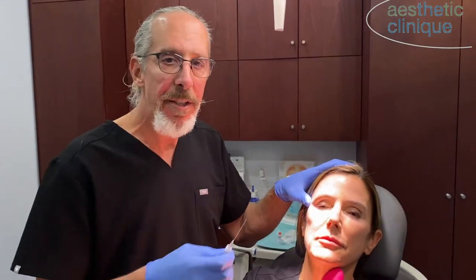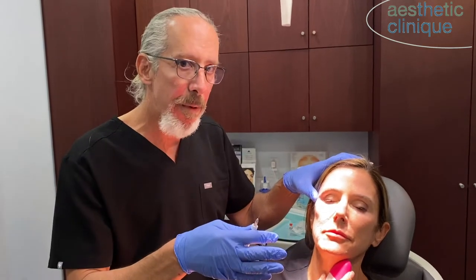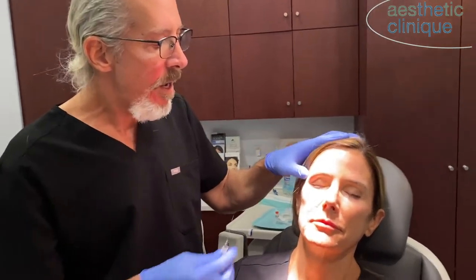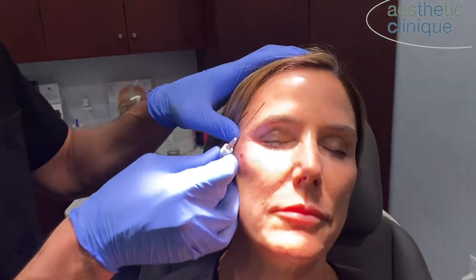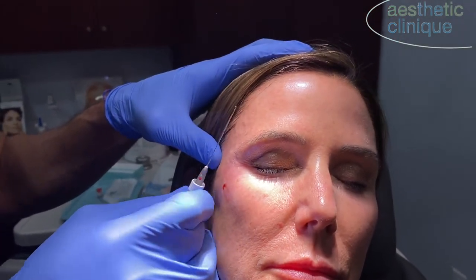So it's an interfacial plane that I like to do — between the superficial temporal fascia and the superficial layer of the deep temporal fascia. That should be a glide plane; it should be avascular, and it creates a very robust correction. It's a great correction for the temple. You can also get into the brow that way, and you can get into the supraorbital area as well.